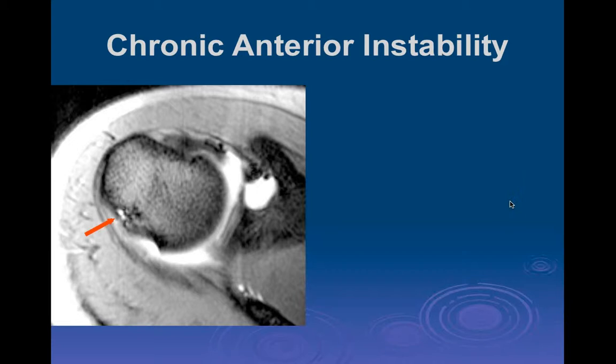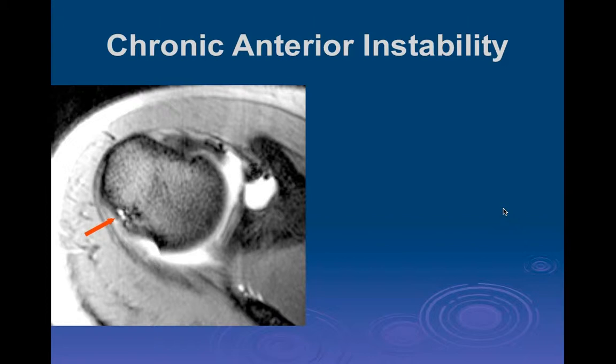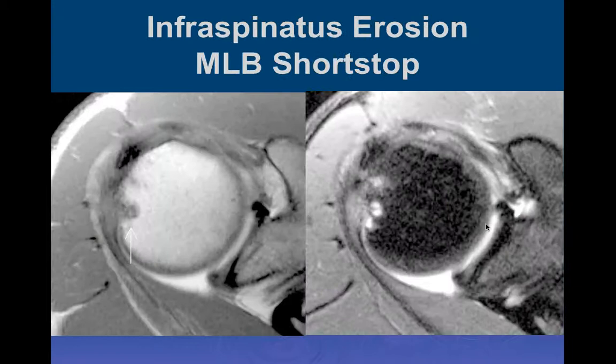We've already been seeing a lot of these typical V-shaped appearances of the Hill-Sachs impaction injury. This is on 3/20/2003. Over time, you can see that the bone injury, the acute part and edema, can resolve, and you can be left with just a little indentation here. This is typical of an old Hill-Sachs impaction injury.